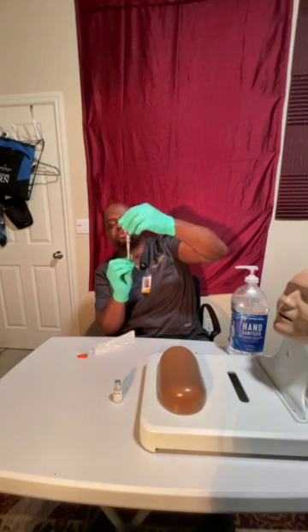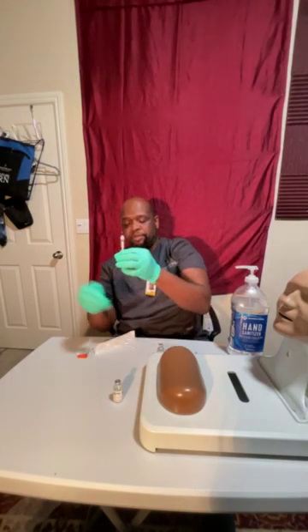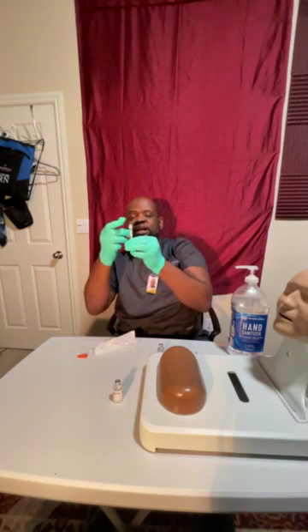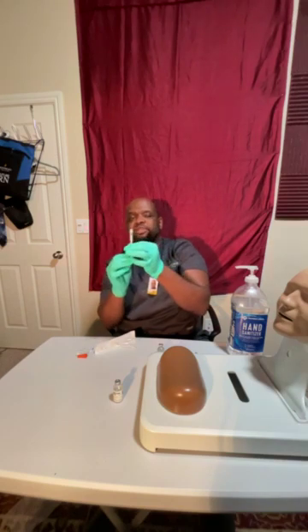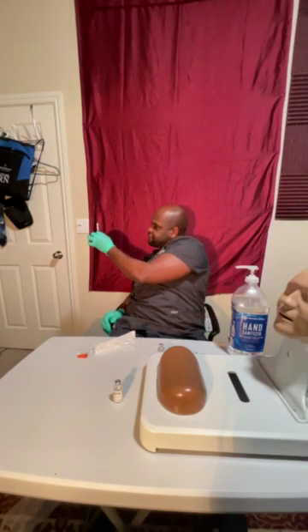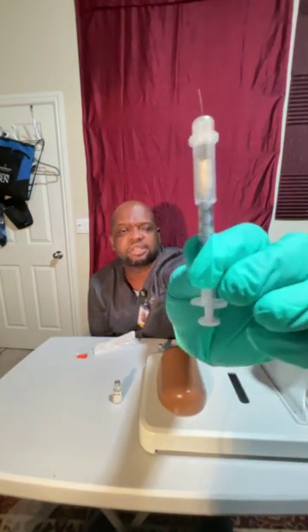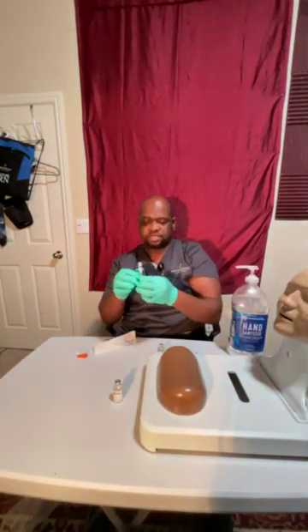So on this one, we want to always make sure we don't have air bubbles. So we want to remove the syringe from the bottle because this is insulin, and we're going to be mixing it with another one. We want to remove the syringe and tap it. If there's any air bubbles, then we want to just gently press on the plunger to get the air out. And then from there, we'll have Agnes confirm. She confirmed there's nothing there. And then have you guys take a look at it. Right, there's 4 units.